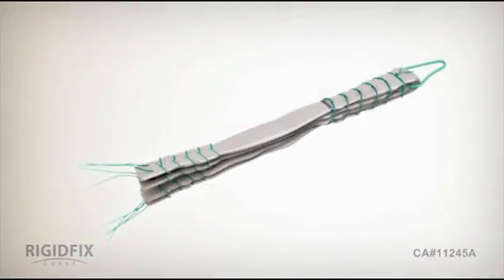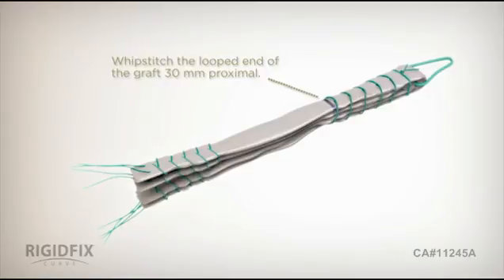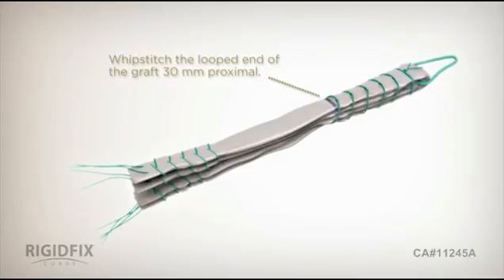First, harvest and prepare the soft tissue graft by folding it in half. Whip stitch the looped end of the graft for a total of 30 mm and mark the graft at 30 mm. Use the sizing block to measure the graft's diameter.